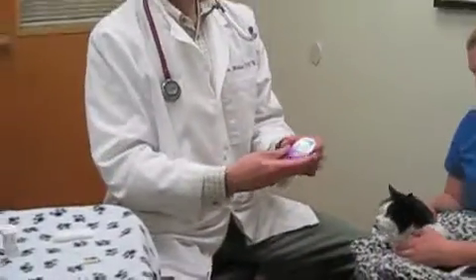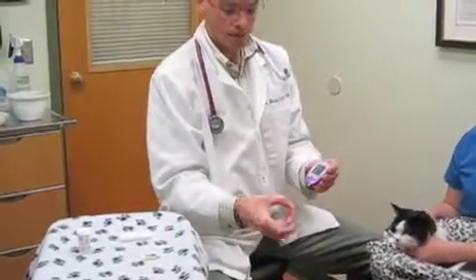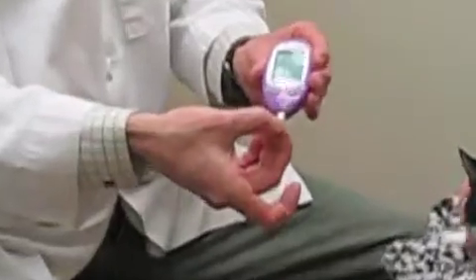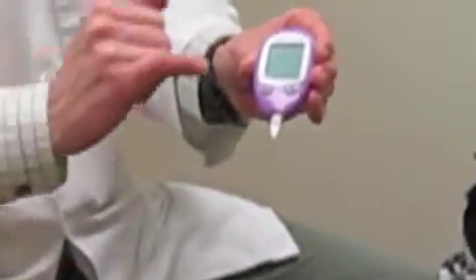So we've got our monitor. We're going to take our blood glucose strip — the two dots are pointing out and the little butterfly is in the center. We push it in and it comes on. Your veterinarian will have made sure it was calibrated for the proper strip.